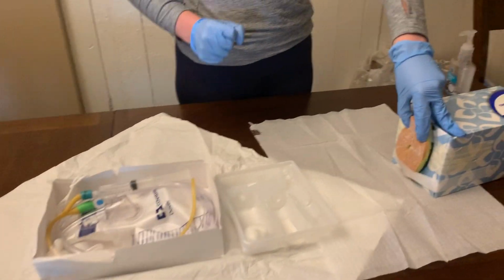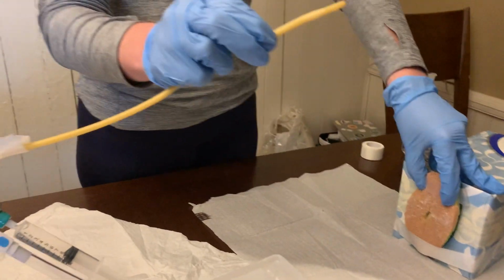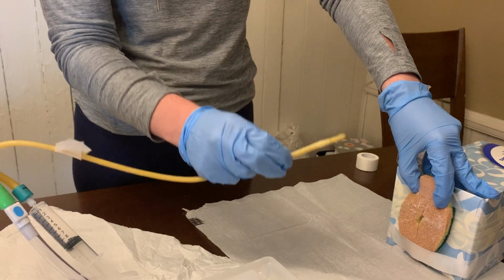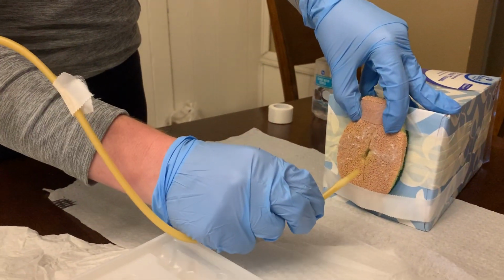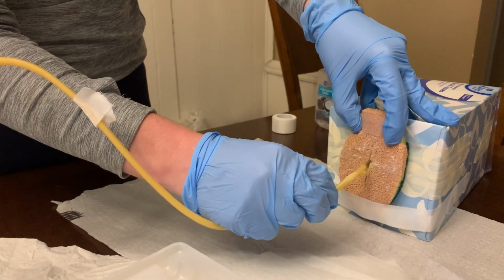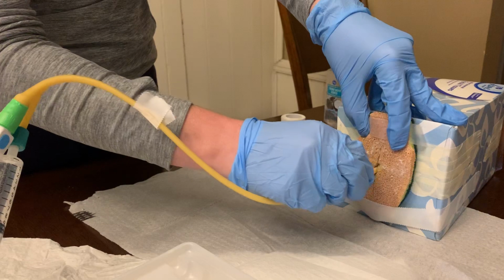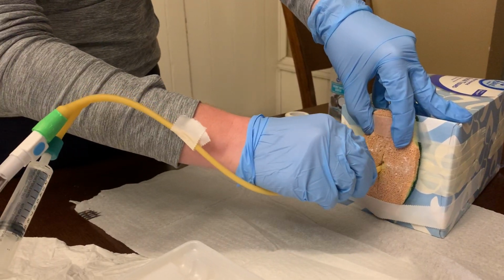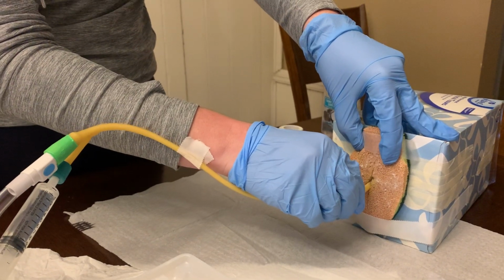So keeping that hand in place, I'm then going to grab my catheter. I'm going to hold it about 2 to 3 inches from the tip, and I'm going to begin to insert it after I ask my patient to take a nice deep breath, and as I insert it, they can exhale. So I will insert the catheter until I see urine in the tubing, and then once I see that urine, I can advance 1 to 2 inches more.